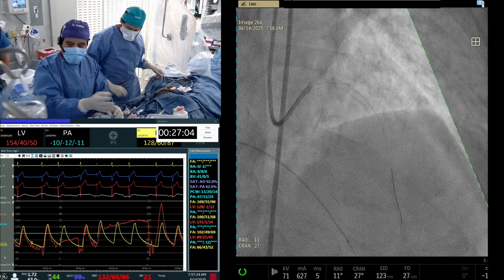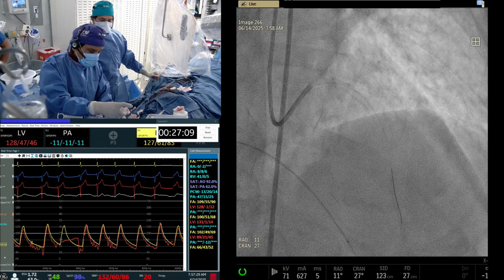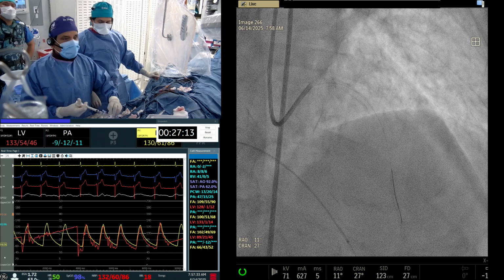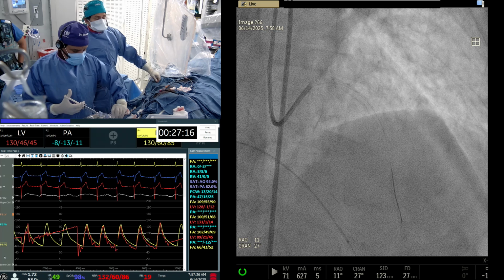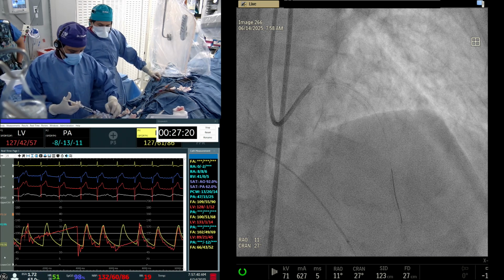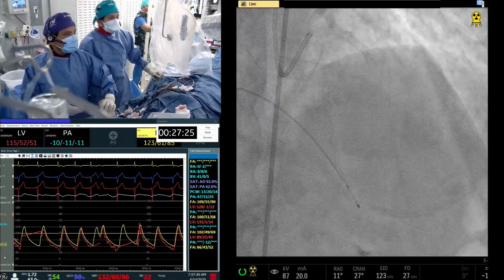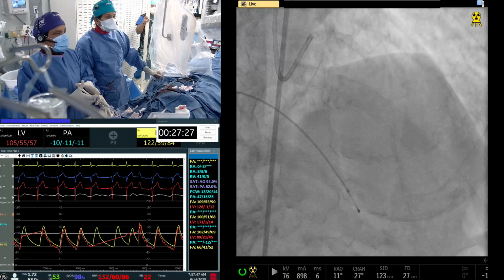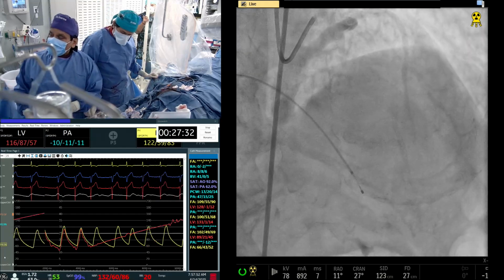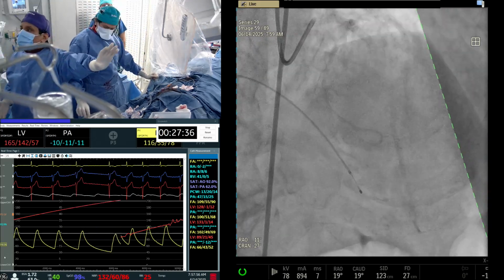Avoid the nitro in this situation, because nitride may decrease the pressure, then you have to push a little more. Okay, good. All right. Great flow. Great results. Fantastic. And see, apex, it was all a vasodilator issue.